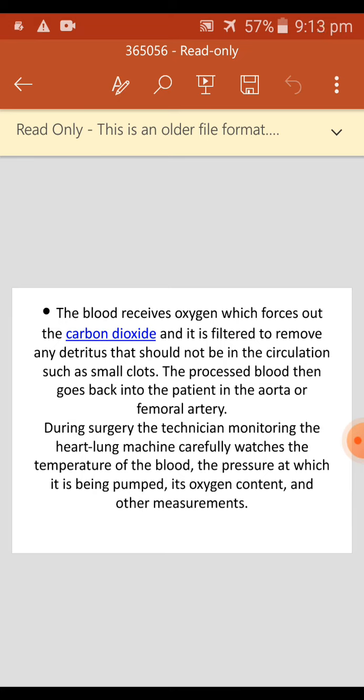Another component of the heart-lung machine is the anesthetic gas vaporizer, allowing and displaying the administration of a precisely dosed amount of anesthetic gas to the oxygenator. Second one, electronic documentation system that displays and stores all relevant data during perfusion. All data are stored centrally and displayed instantly as a perfusion report, which allows for data evaluation at a later stage for statistical and scientific purposes.